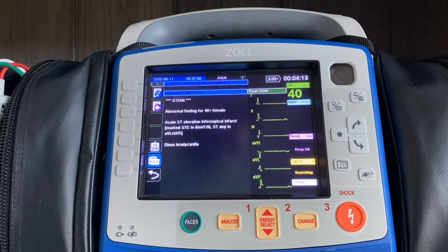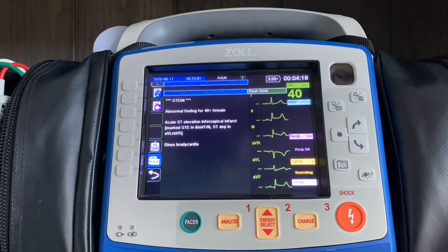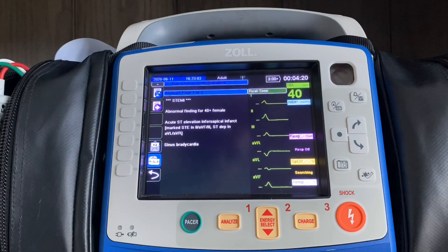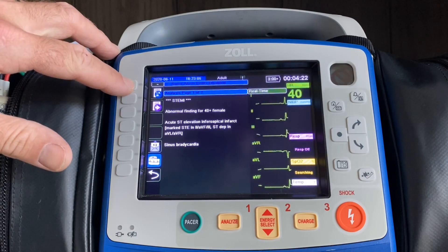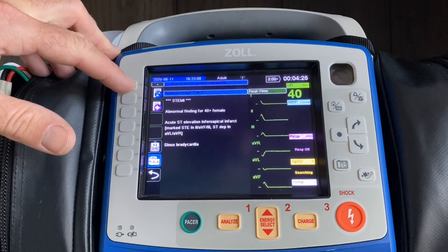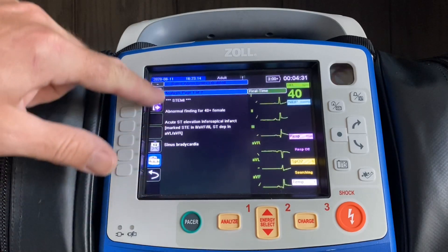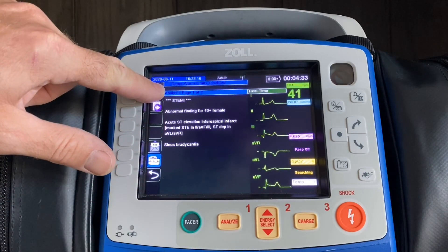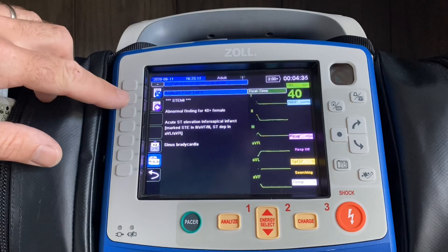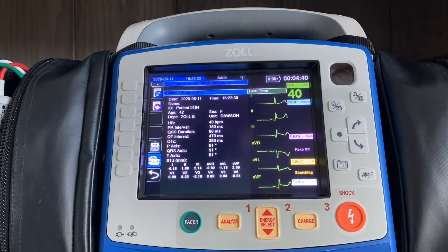As the paper prints out, the right-hand side of the screen stays in a dynamic view so you can compare to what you see on the strip. You can change between the limb leads and the V leads by hitting the first button labeled one, two, three. The second button down allows you to change the initial screen — which shows your interpretive statement — into a screen that shows you your QRS intervals and, importantly, your J-point measurements, which we'll look at on the strip as well.